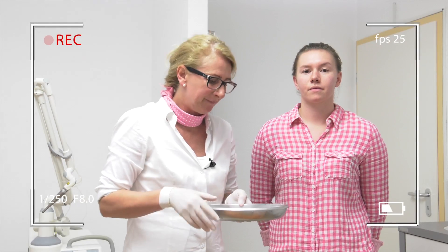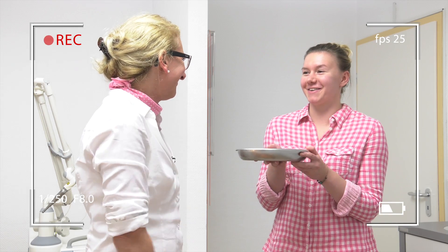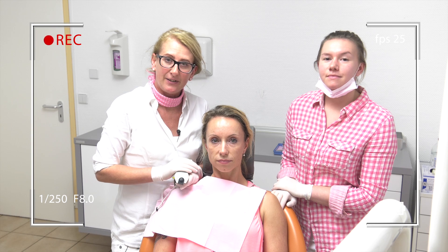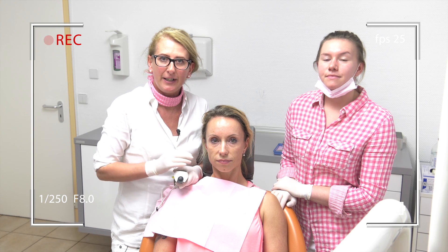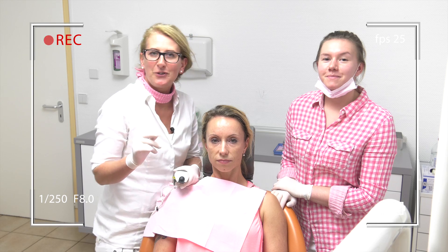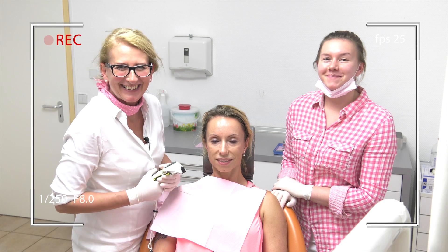Frau Ubele, viel Spaß. Thank you. You can see that the sealing has a very good bond to the surface.